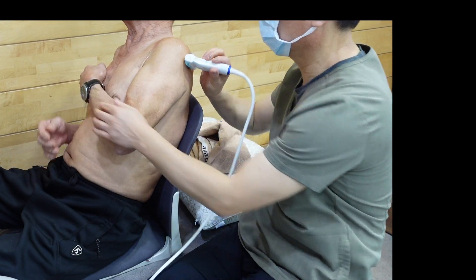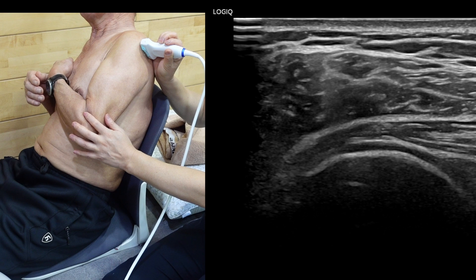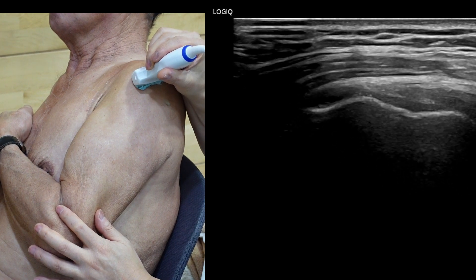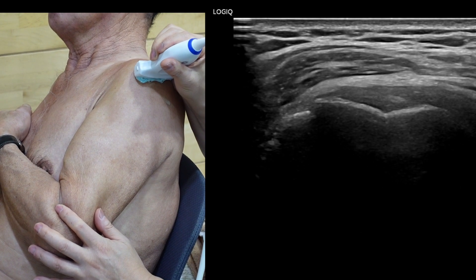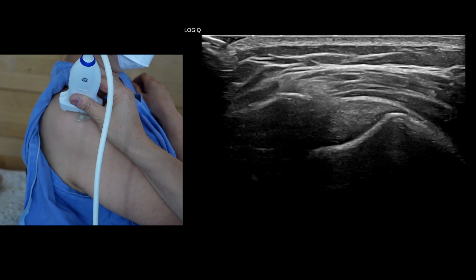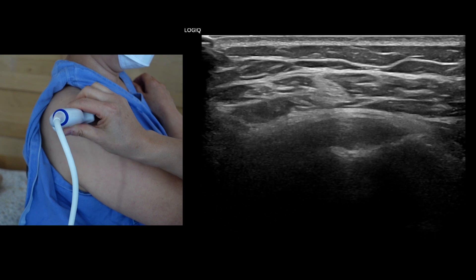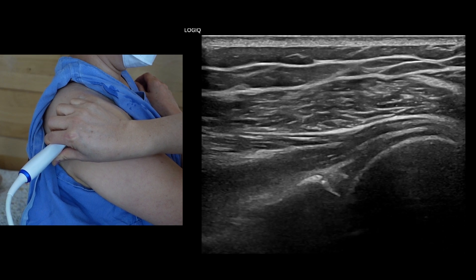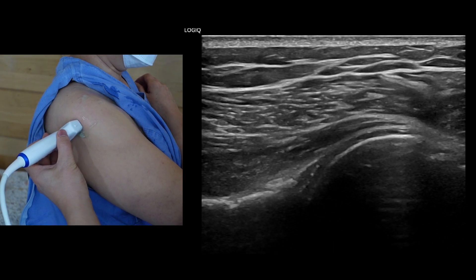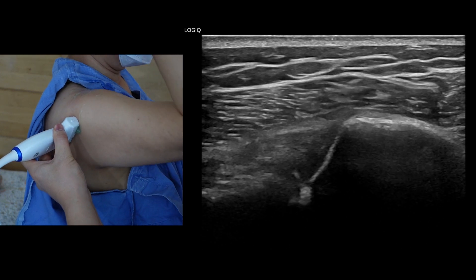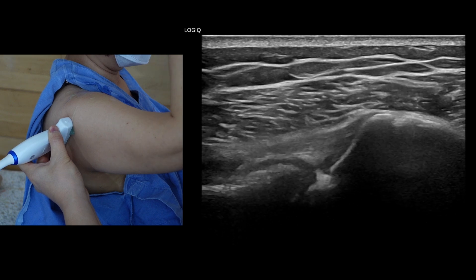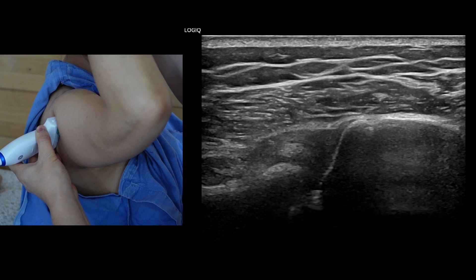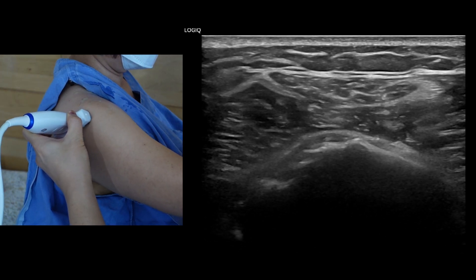Lastly, to assess the infraspinatus and teres minor tendons, position the ultrasound transducer on the posterior aspect of the glenohumeral joint, with the patient placing their hand on the opposite shoulder. Use the junction of the posterior edge of the acromion and the scapular spine as a landmark for the infraspinatus tendon. Clinically significant infraspinatus tendon tears are relatively uncommon unless there is an associated massive supraspinatus tendon tear. In some cases, internal impingement may occur, involving the posterior labrum and the internal corner of the posterior supraspinatus or infraspinatus tendon, which can cause pain during the wind-up or arm elevation positions.